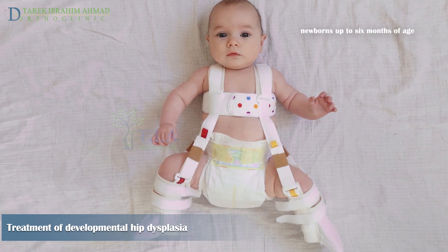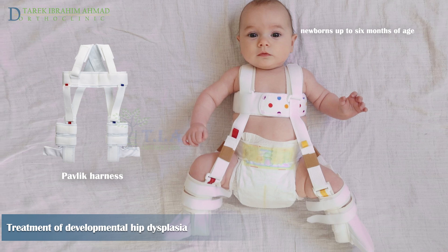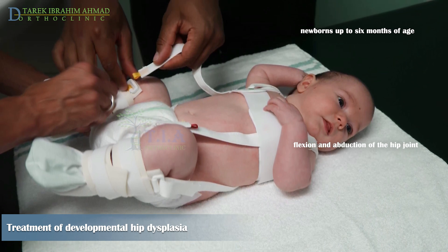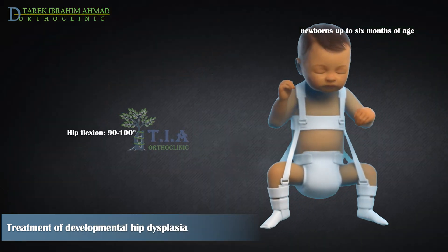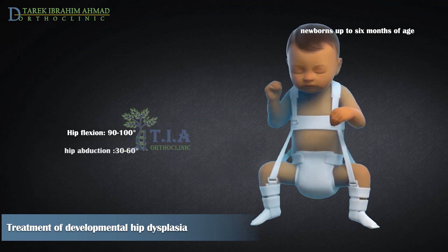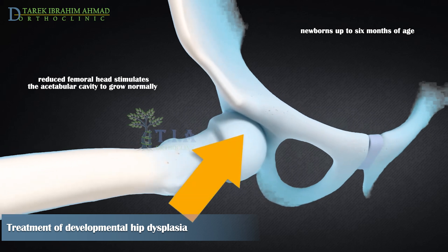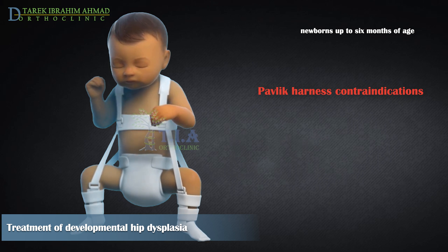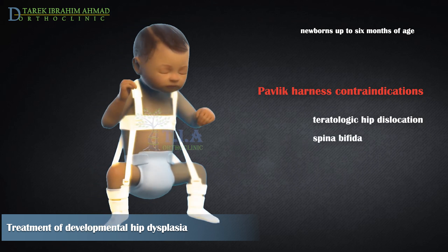For babies younger than six months, treatment is usually with an orthosis. The most commonly used orthosis today is Pavlik's harness, which provides simultaneous flexion and abduction of the hip through connected straps. Anterior straps flex the hips to 90–100 degrees and prevent extension; posterior straps prevent adduction. The treatment relies on keeping the reduced hip in flexion and slight abduction to stimulate normal joint development. Pavlik harness requires normal muscle function and is contraindicated in teratologic dislocations and patients with spina bifida or spasticity.